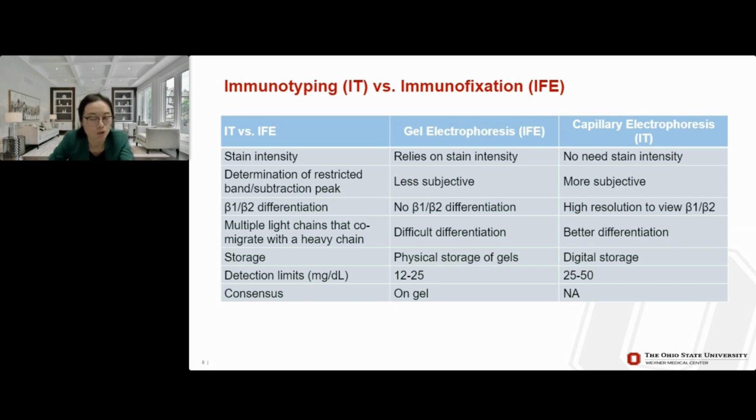The storage of data is quite different too. We need to have space to store gels physically, but we only need to store digital data for capillary electrophoresis. The detection limit is slightly different. We can see gel electrophoresis is slightly more sensitive than capillary.